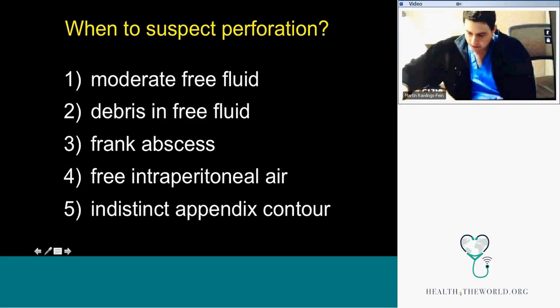And then consider, and this one's a little bit more subtle and subjective, you can see the appendix really well, but the wall, either on ultrasound or CT, starts to look a little fuzzy. You can follow the wall, but then there's a certain part where it just doesn't look quite right. It makes you wonder if that wall broke down.